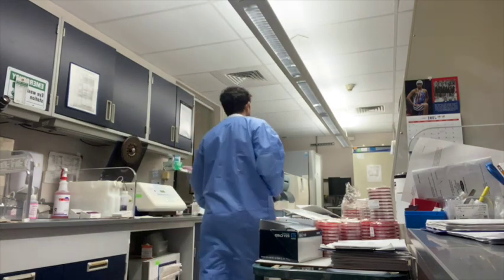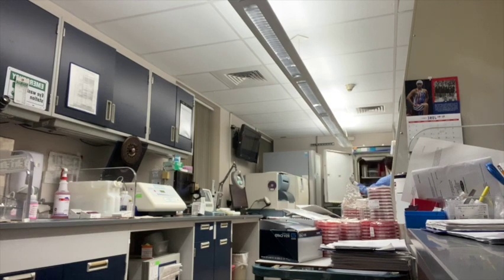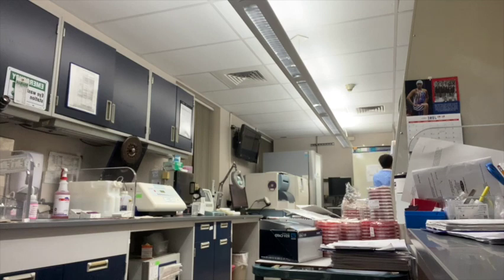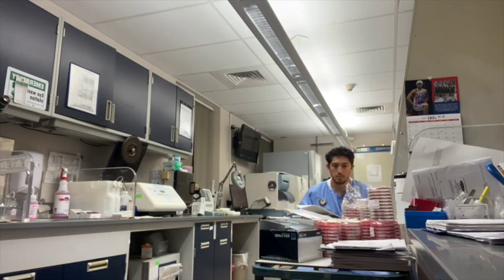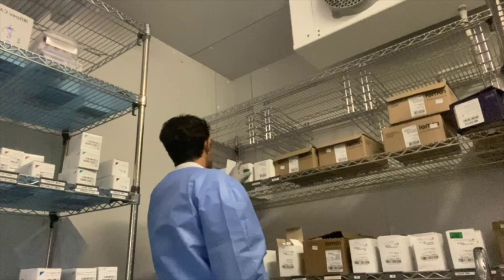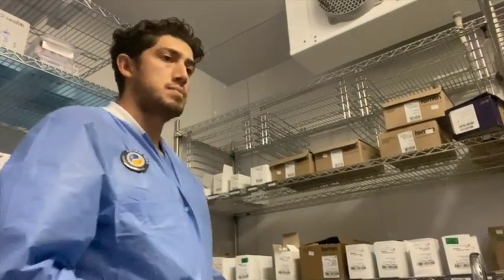Another key aspect of my job is working in the microbiology department. Here I am analyzing temperature to make sure that everything is stable. I'm also making sure that the department is stocked. Anything that I see running low, I go ahead and go restock it. So here I am in the walk-in fridge grabbing some more gel plates.